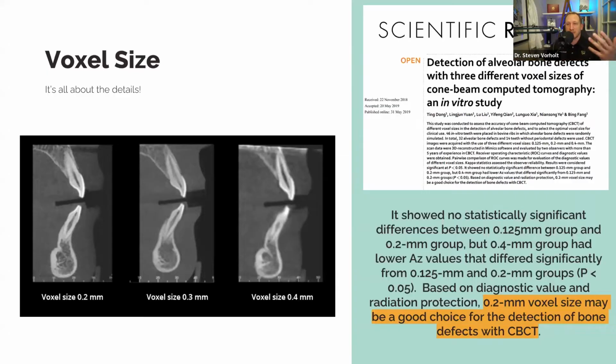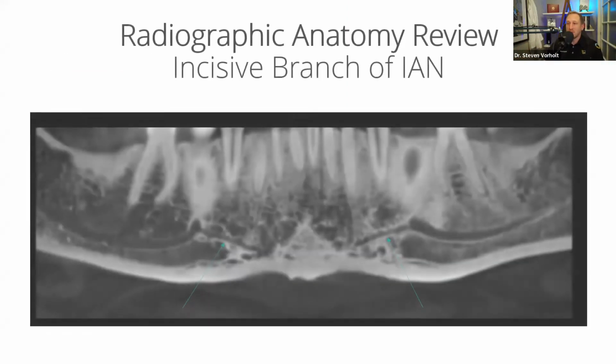But do double check that, because when you're going to buy a CT, they're going to tell you their best voxel. They're going to tell you their tight 5x5 field of view voxel. So make sure you also know what the voxel is when they go full field of view as far as the scanning goes. Okay, so what can we see at 0.2?